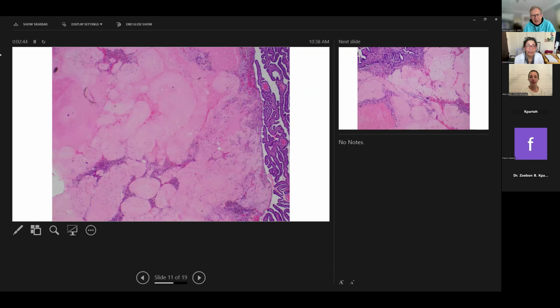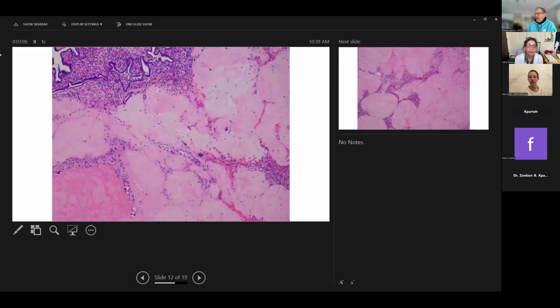But I had never seen this in a tube before. And so the question came to mind, well, is this related to her recent gestation? Is this just a decidual placental site related to the current gestation that she just delivered? Or is this, in fact, as I ultimately came to believe, more likely a placental site nodule related to a prior ectopic pregnancy that has involuted without rupture, without therapy, and so forth.